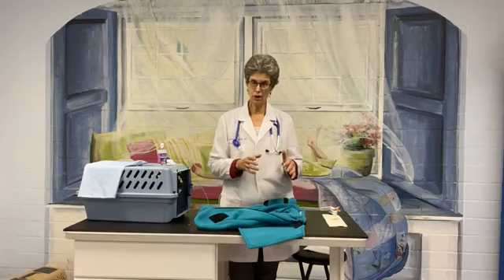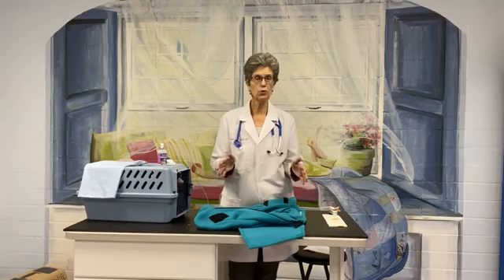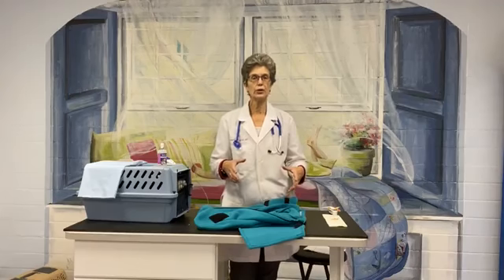We want to make this easy, not rushed, and not forceful on the cat. Because it doesn't matter what kind of tool you're using for calming, if you're trying to push the cat into it or make the cat go into it, then you're making it stressful for them.